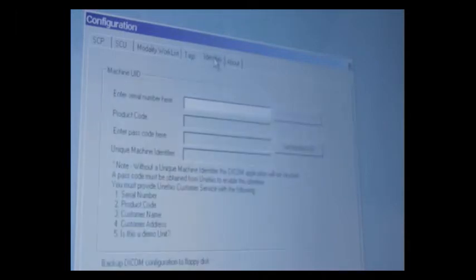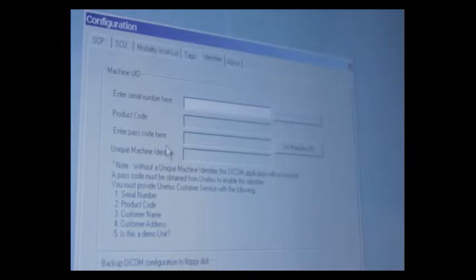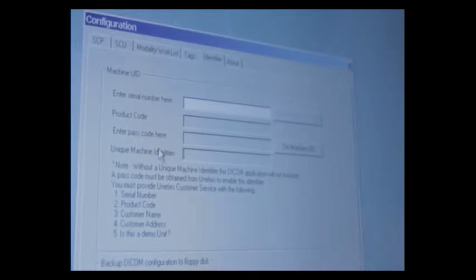Tags is nothing we really need to talk about at this particular point. However, identifier is very important. If you do not have a serial number in this box here and a unique machine identifier in this box right here, your DICOM is not enabled and you must contact Unetix to have your DICOM set up.